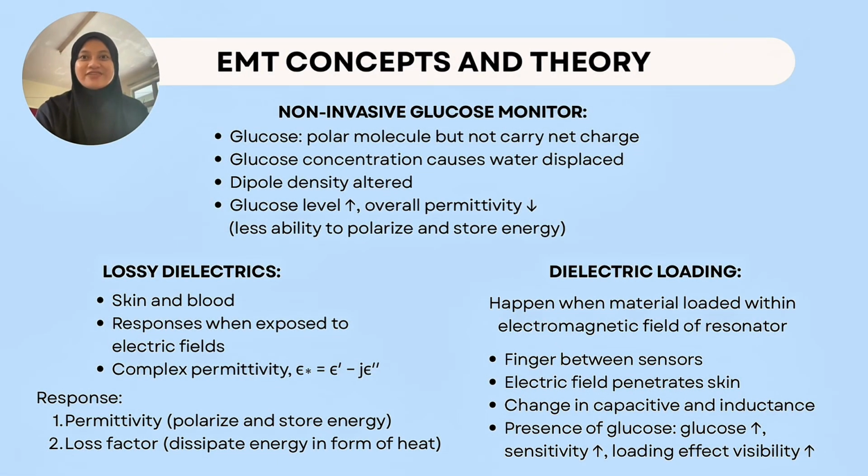For a non-invasive glucose monitor, in monitoring glucose level, we must know that glucose is a polar molecule, but it does not carry any net charge. From its concentration, it can cause the water molecules to displace, thus dipole density is altered. When the glucose level increases, the overall permittivity also decreases. The ability to polarize and store energy becomes lesser.